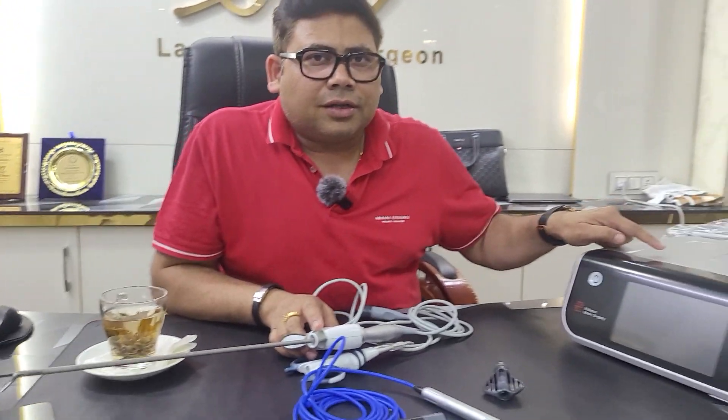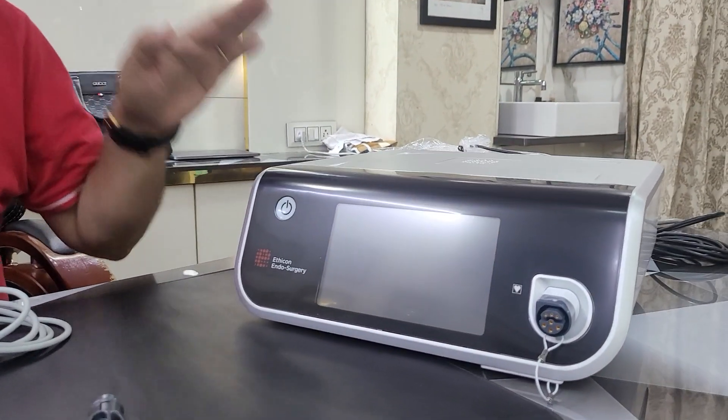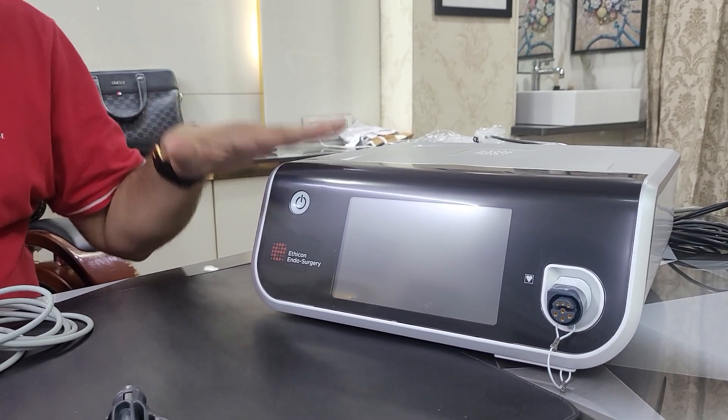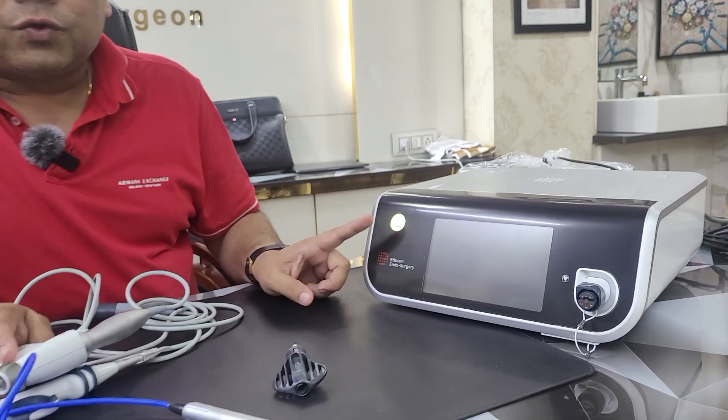The next thing is this: your ultrasonic generator, which is very important. The machine I am showing you is the latest one — this is Generation 11. I have already shown you Generation 3 and Generation 4 in my OT. What is the difference between the older and the new one? The older were hardware-based, and this is totally microprocessor-based, chip-based. I have switched it on.